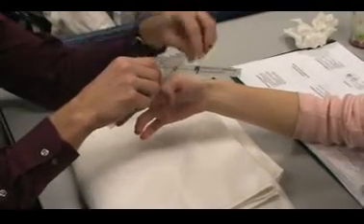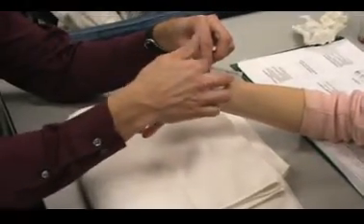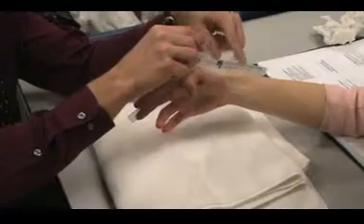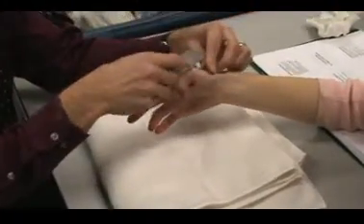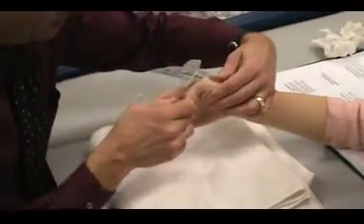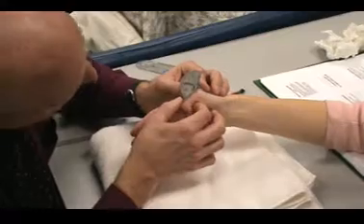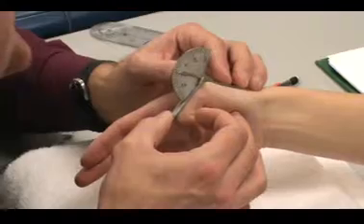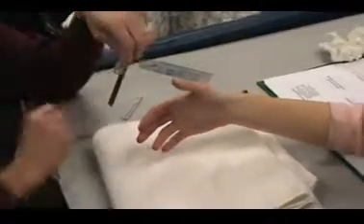I line up — axis is over the MCP. You can see how these longer goniometers can sometimes throw you off. If I go this way, I have less getting in the way of what I'm doing. And then I can measure her thumb. Is that as far as you can go, ma'am? And I have 60 degrees of MCP flexion at the thumb.